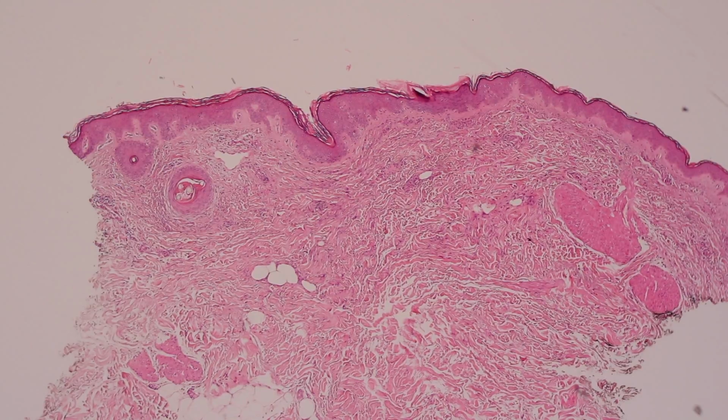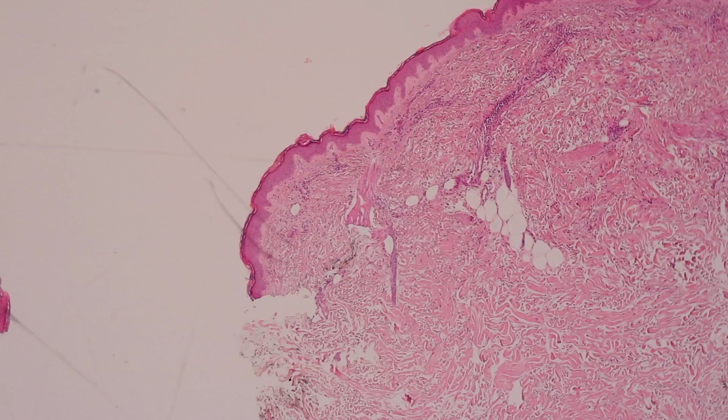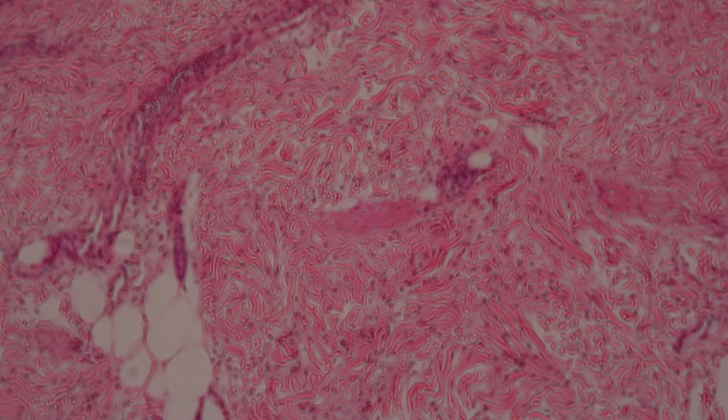Now, I apologize, this is a faded biopsy. This is not ischemia. This is just an old H&E stain, but this is something that I don't see very often, so the only one I have to show you is an older example.